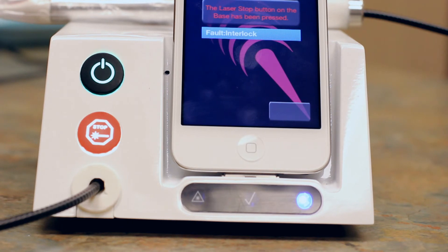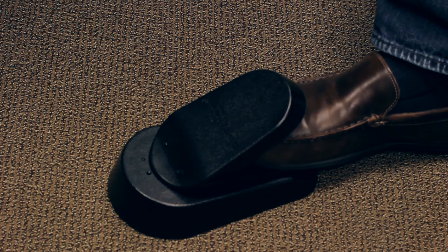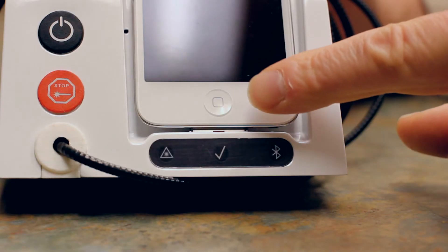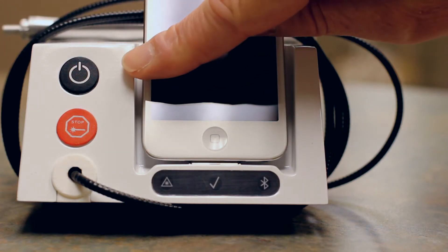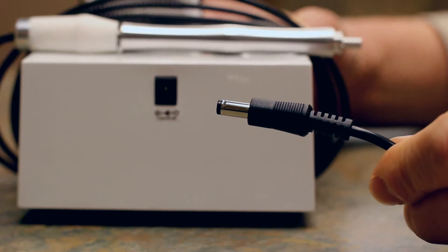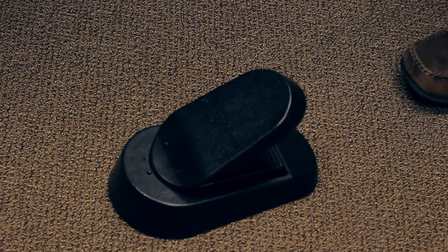If this happens, you will need to press the laser stop on the base, then clear the warning message on the display. There are other ways to stop the laser quickly: release the foot pedal, press the home button on the iPod, press the power button on the base, or remove the power cord from the back of the base. If your laser is still firing, remove your foot from the pedal.